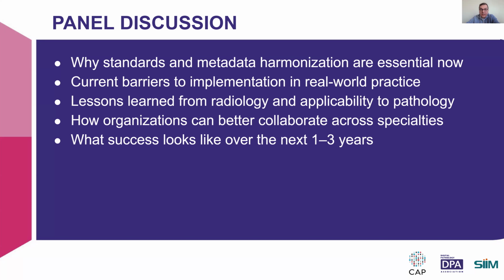Dash, and also Kevin mentioned, which is the most important one, the supplement 145, that really did exactly the whole slide imaging. So the pathology images and radiology images live under the same standard, use the same foundational metadata structure, and can really be used as one standard when correctly implemented. That's the most important thing. So we really need to work with the vendors and take out this confusion that usually comes from inconsistent vendor implementation, not from the standard itself by having multiple flavors.